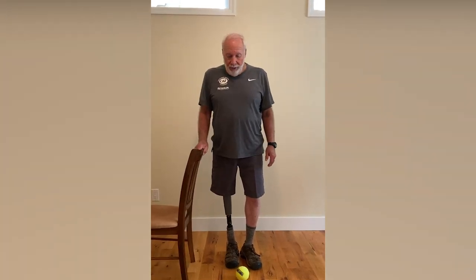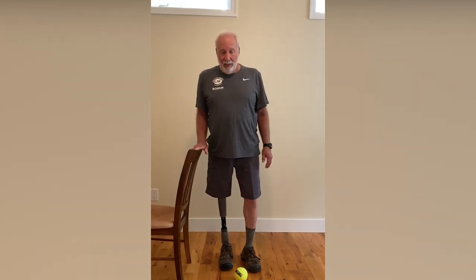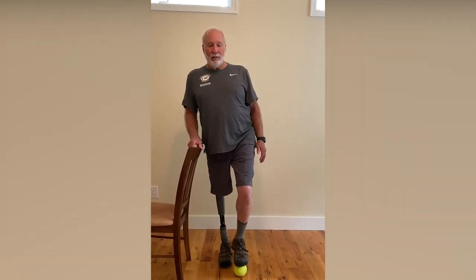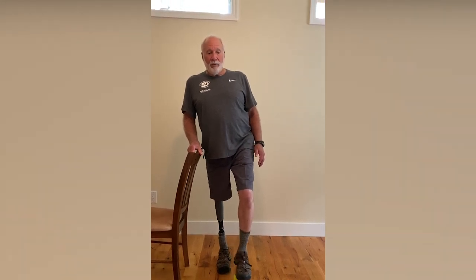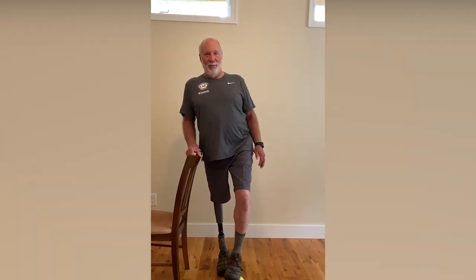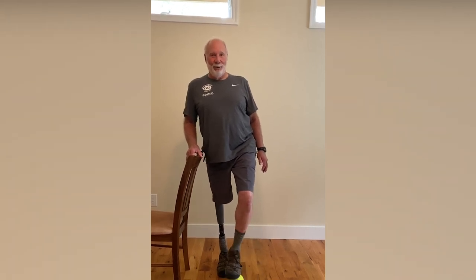But what you do is you stand, put your weight on your prosthetic limb. You can hold on to your chair, try not to rely too much on it. Put your foot on the ball and do 10 to 20 times forward and back with the ball. And then 10 to 20 times side to side with the ball. And I can already feel the muscles in my socket burning from this. It seems real simple, but you will be amazed at how much work you have to do.